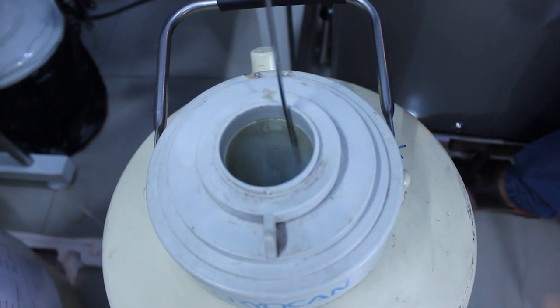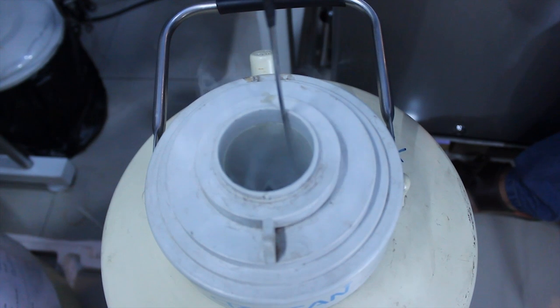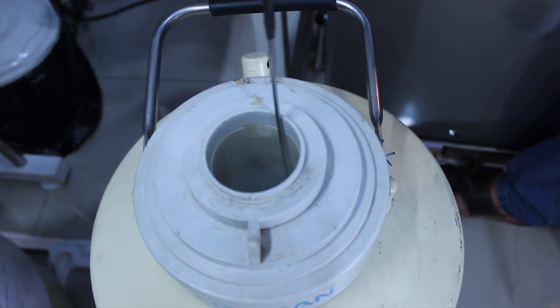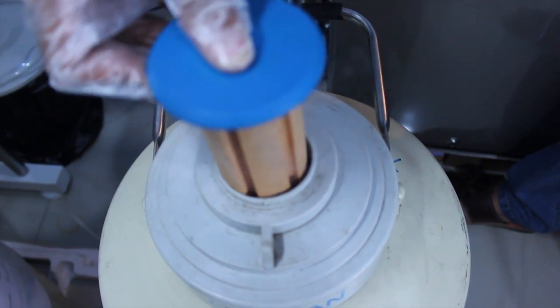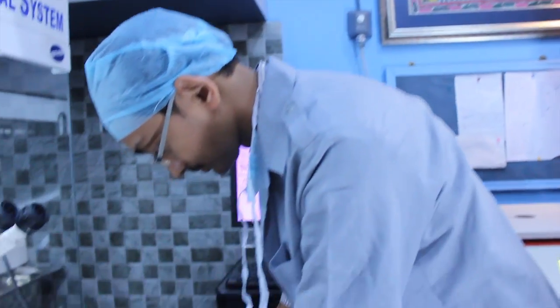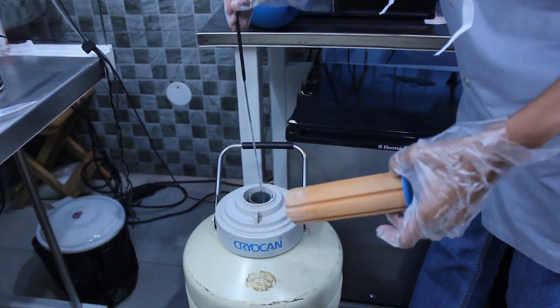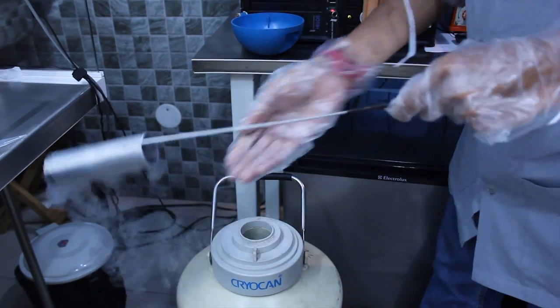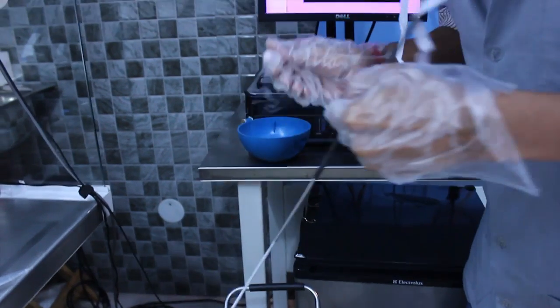The sample is now kept in liquid nitrogen vapor for 20 minutes. After 20 minutes, the sample is taken out.